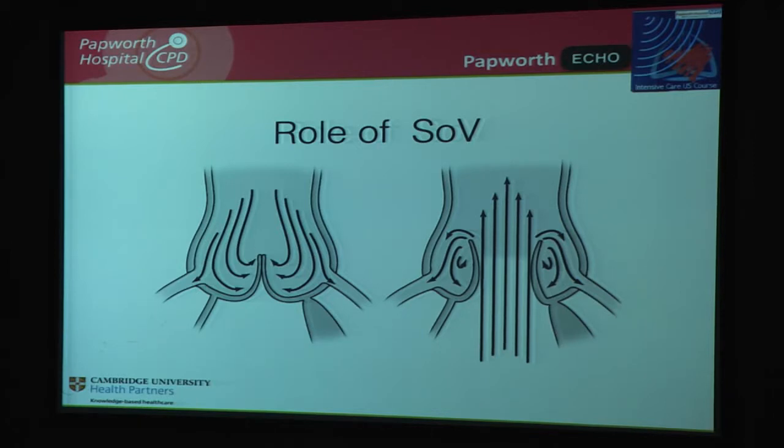And in systole, the sinuses actually create eddy currents between the valve leaflet and the aortic valve wall. So this will prevent the leaflets from abutting against the coronary sinus, though this is not as important. But what it more importantly does is push the aortic valve to shut quickly in diastole so that early diastolic regurgitation is prevented. So this is what happens normally.